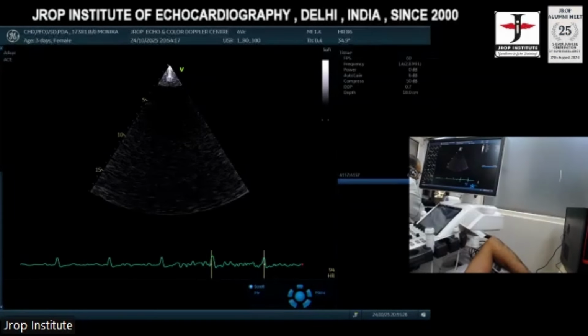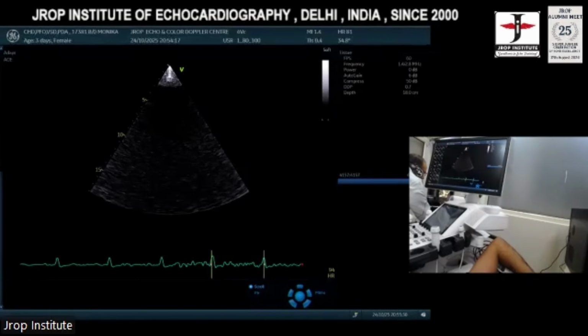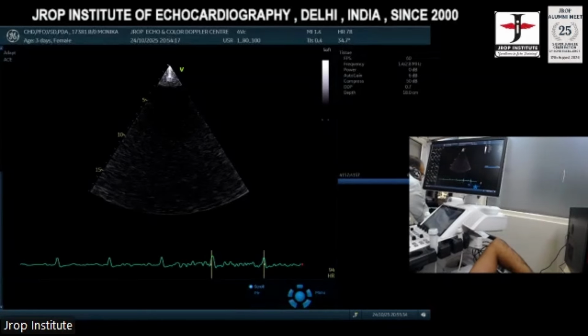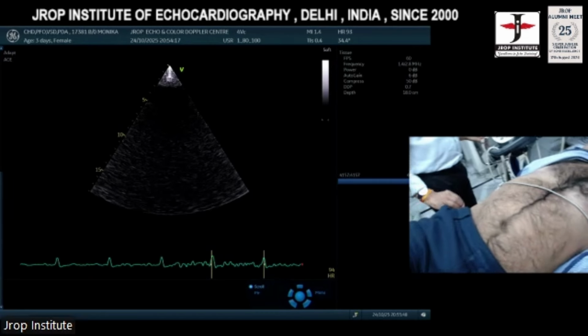Dr. Ajay Chaurasia: Sir, it is quite easier for us to get the parasternal and apical views, but when it comes to subcostal, we don't get the directions well, and many times I don't get the chambers at all. So how to exactly approach it? That is a little difficult for me. I'll show it again. Let the subject lie down flat. See the ratio?